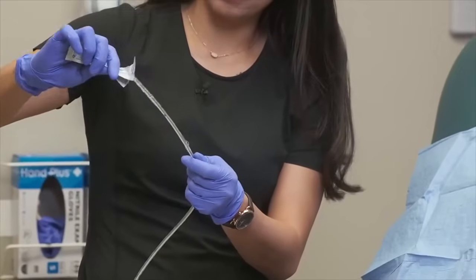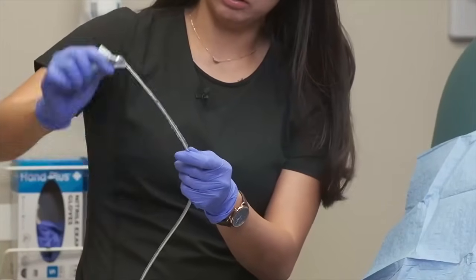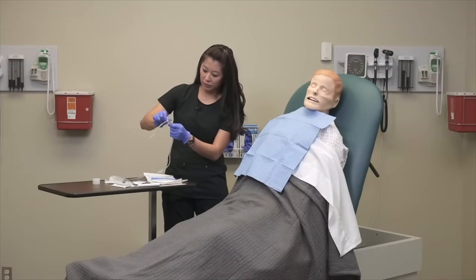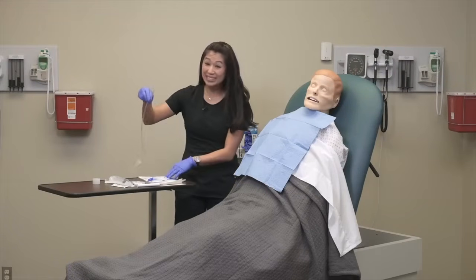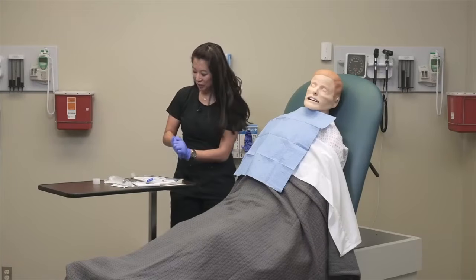This is going to help for much easier advancement of the tube. I'm just going down the tube and making sure it's nice and lubricated. It may seem a little excessive, but it definitely helps provide comfort for your patient.